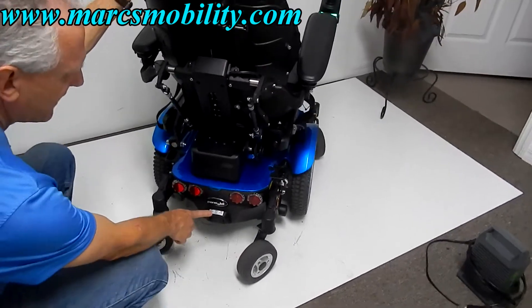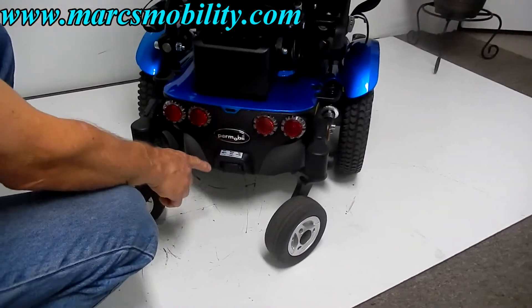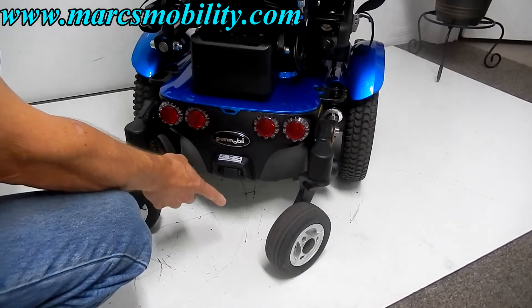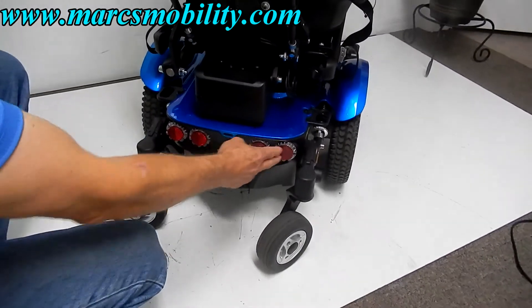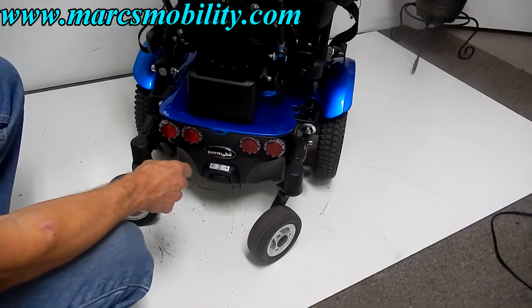Back here you've got your power supply. So if you need to turn the power off on the chair for any particular reason, you can turn the power off over here. You do have reflectors — these are not lights, these are only reflectors.